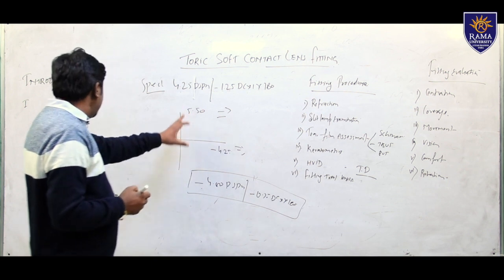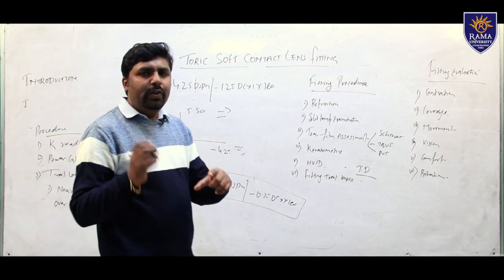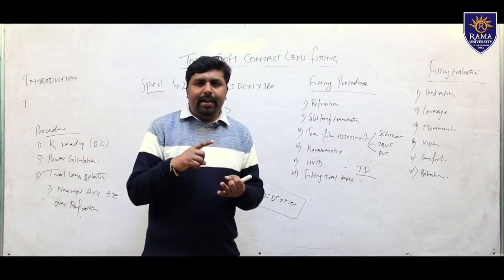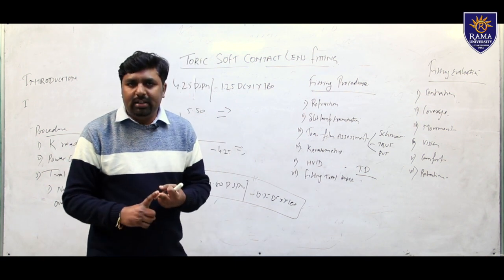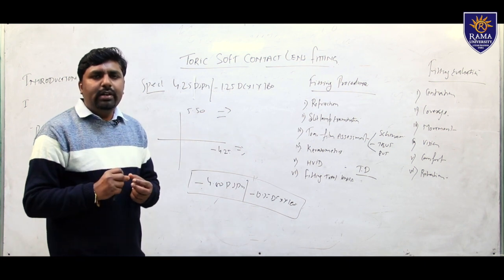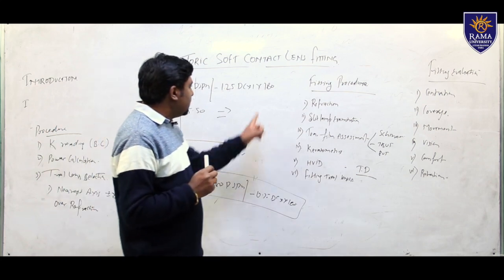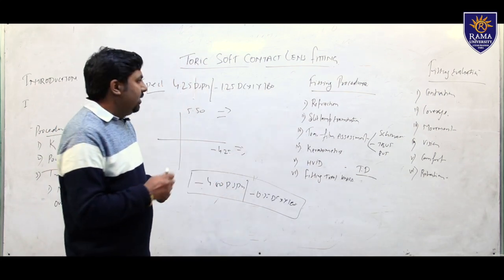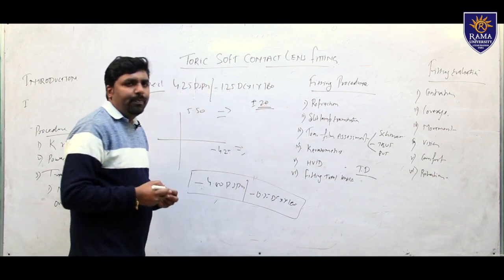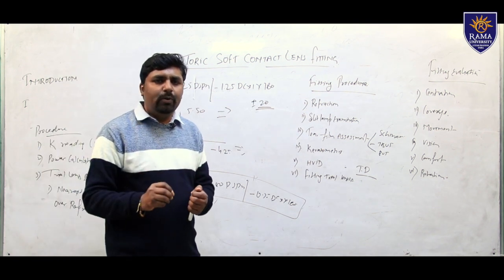And after the calculation of power, we have to select the trial lenses. For trial lens selection, we require the very nearest for the base curve, for the power, and for the axis. Keep in mind, axis is very much required in toric lens fitting. Suppose the axis is 180 degrees, so the nearest value, plus or minus 20 degrees, we can take, or whatever is available in the trial lenses, always find the nearest value.